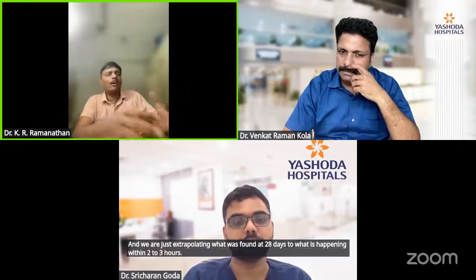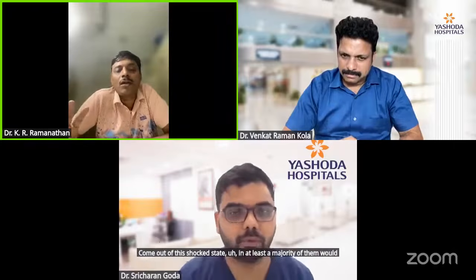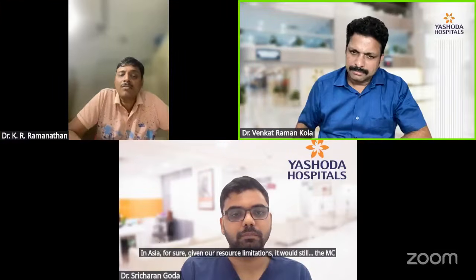You have used IABP quite a lot, Venkat. You clearly know how patients come out of this shock state. At least the majority of them would definitely become more stable when the balloon is on. So I think people who have used it will vouch for it. I don't think IABP will go out of vogue as an MCS device, even though people project it that way. And clearly in Asia, for sure, given our resource limitations, it would remain the first MCS device of choice.